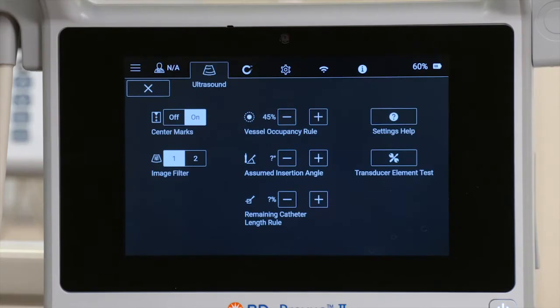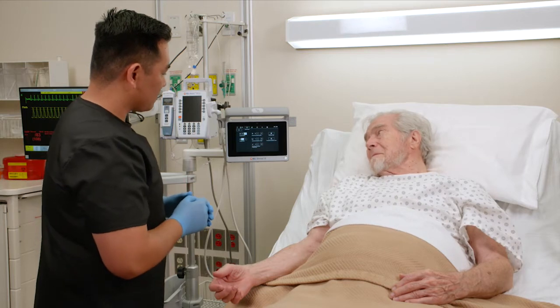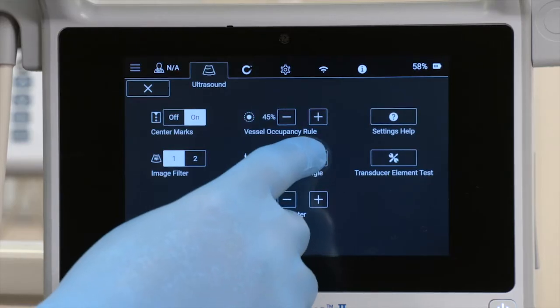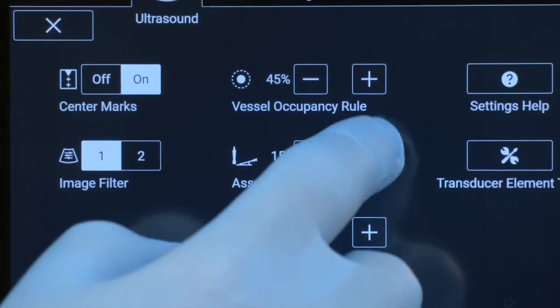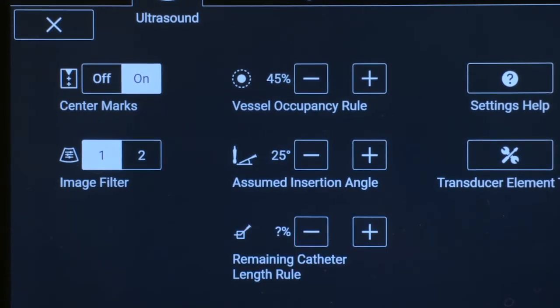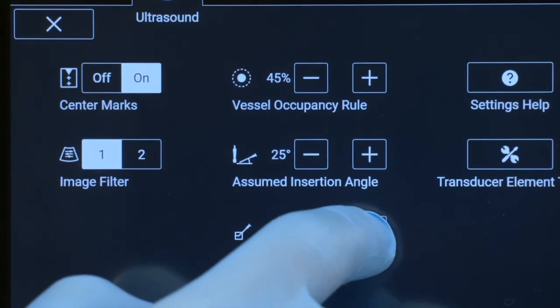The assumed insertion angle is used to help determine the remaining catheter length. Adjust this value to set the anticipated insertion angle that is used while placing a device. The remaining catheter length rule is used to determine the minimum catheter length that complies with this rule.